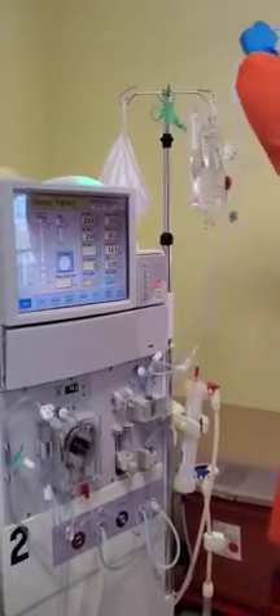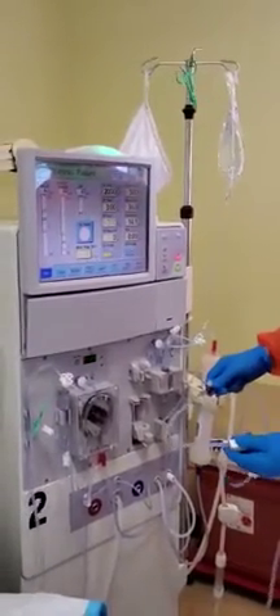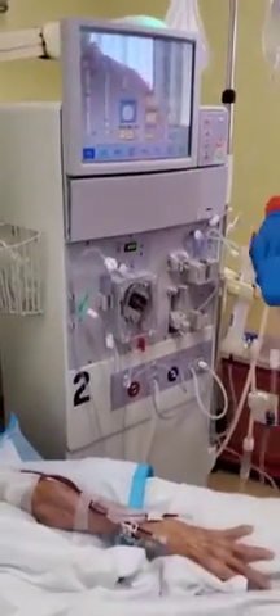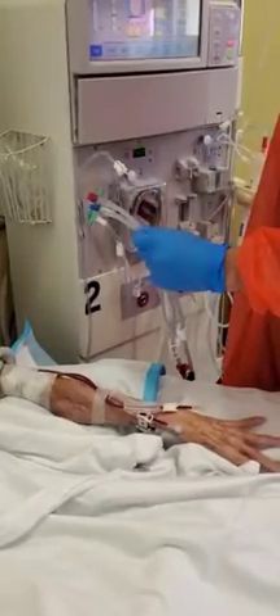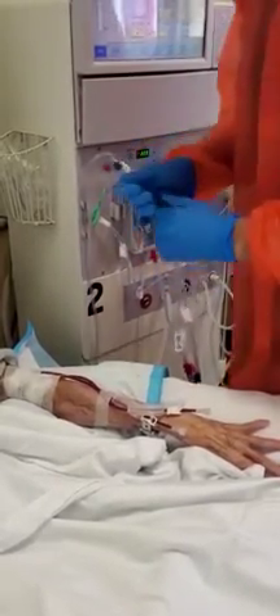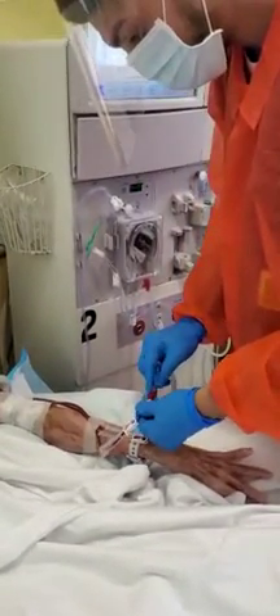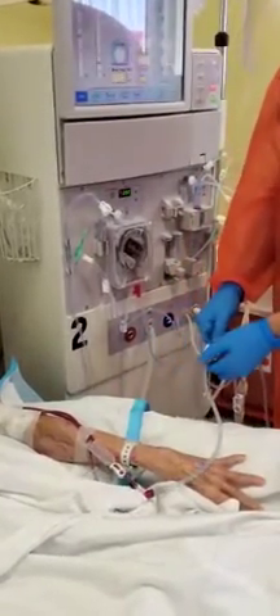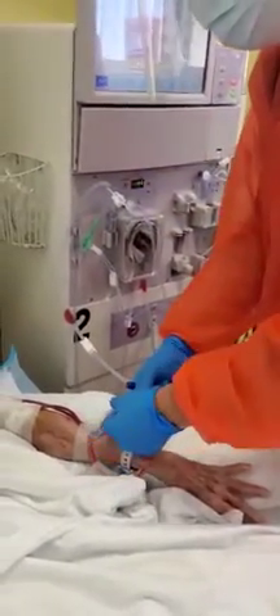You can see there the two patient ends, and he's going to clamp both venous and arterial end. He brings that over to the patient's cannulation lines attached to the needles in her arm. You can see he's connecting the arterial blood line to the cannulation line, opening up the clamps and securing the line.